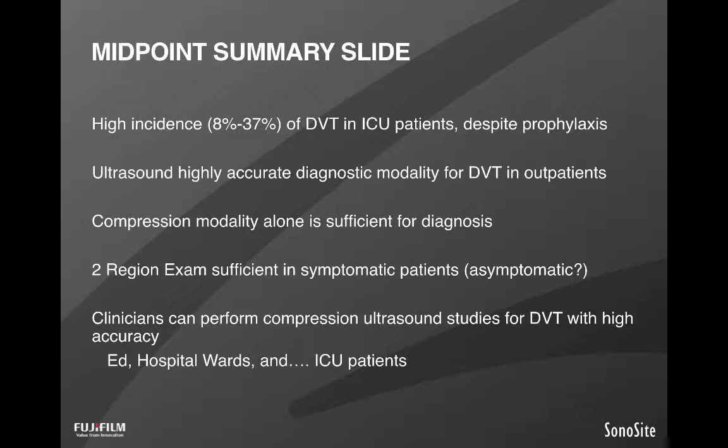And then lastly is that we can do it. You do not need to be an expert ultrasonographer with years or even months of training and experience in order to achieve high accuracy. I would say in all of the webinars that you've seen or will see, or in the other application of ultrasound by point-of-care sonographers, this is probably the one with the steepest learning curve, and one that you can achieve the highest accuracy with rather focused training.